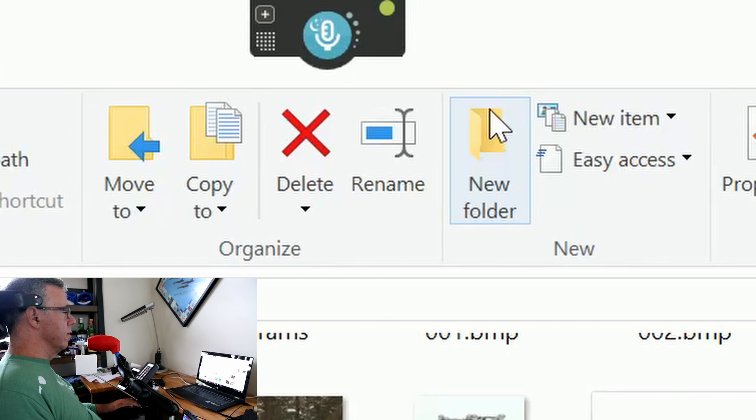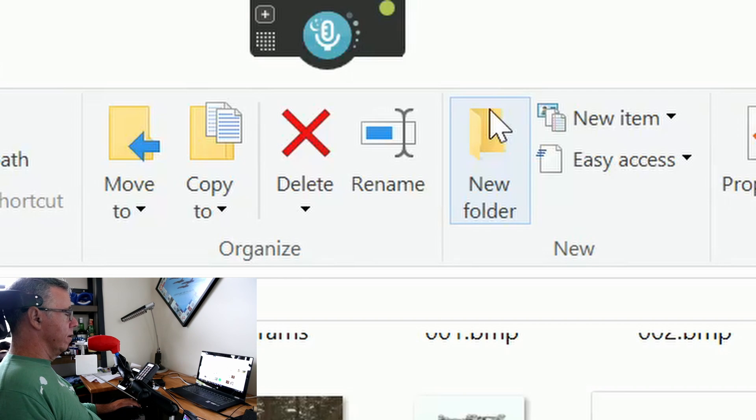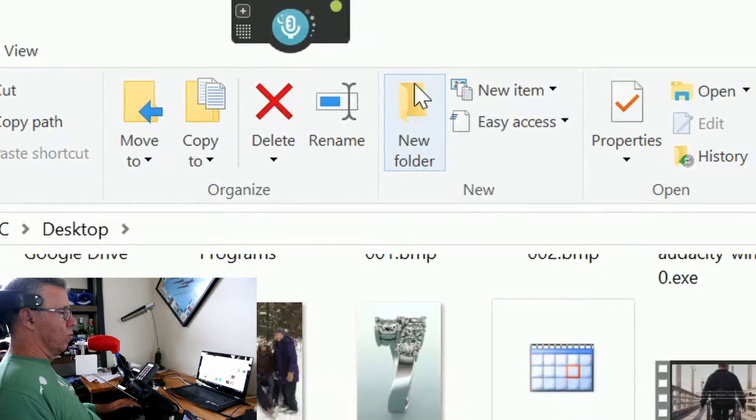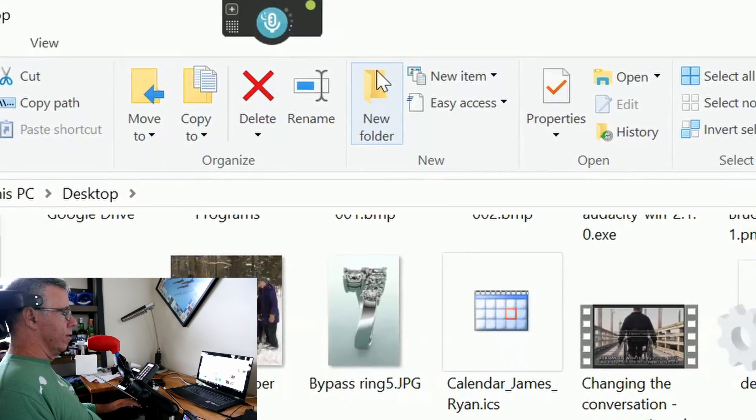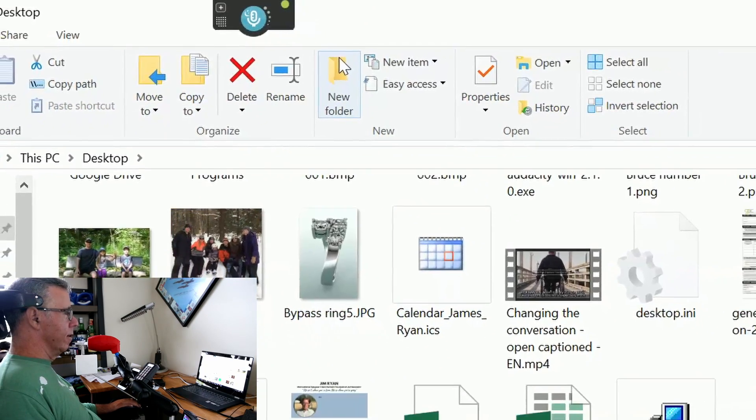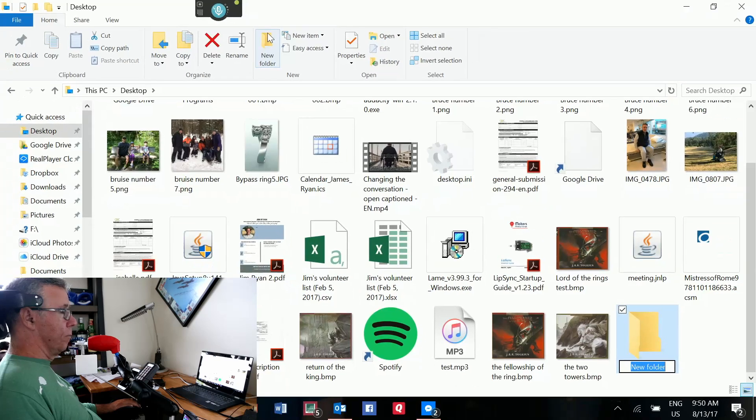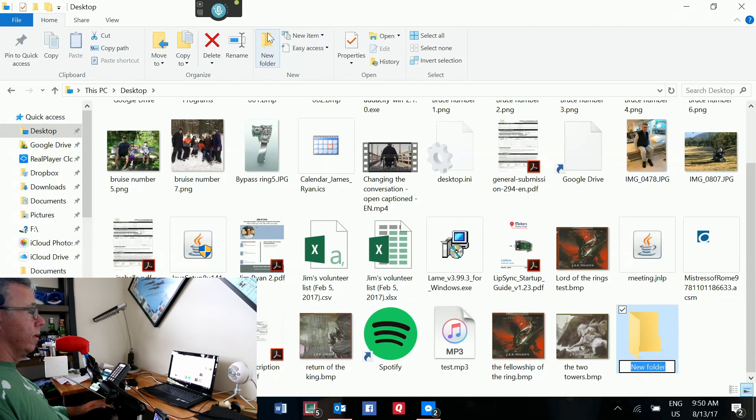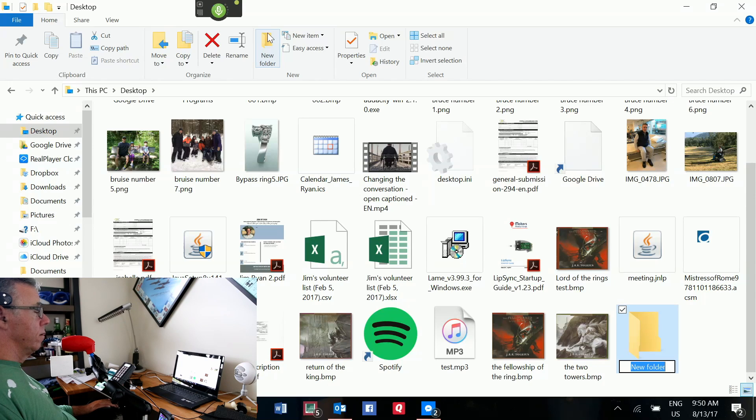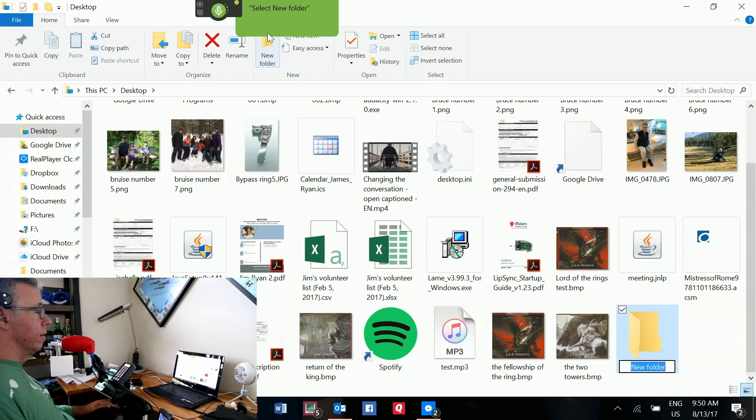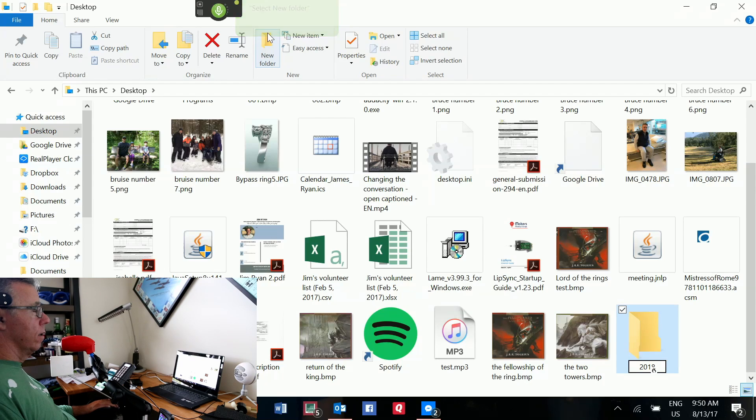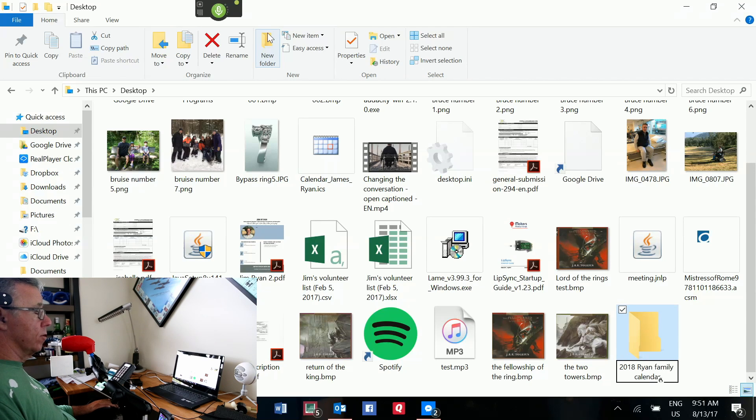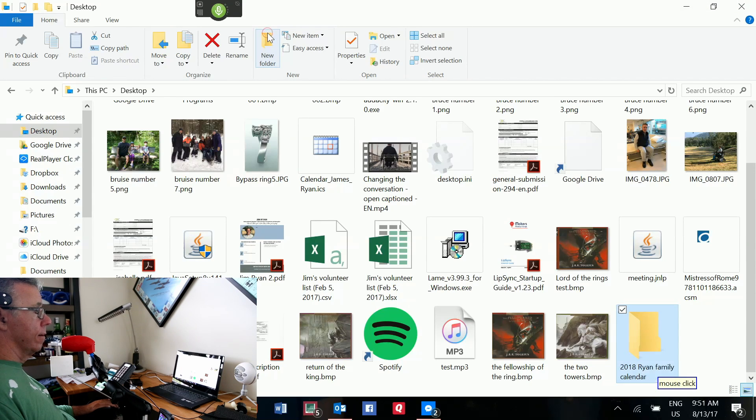Three choices. Green is on, red is off, blue is asleep. So, to start it, I have to say the magic words. And as soon as I say it, the dot will turn green. Okay, here we go. So, all I'm going to say is wake up. 2018. Ryan Family. Calendar. Mouse click. Go to sleep.